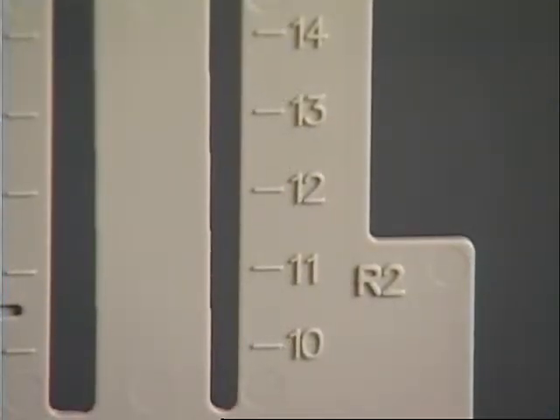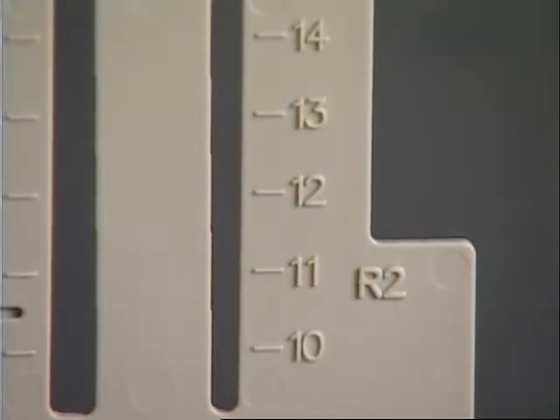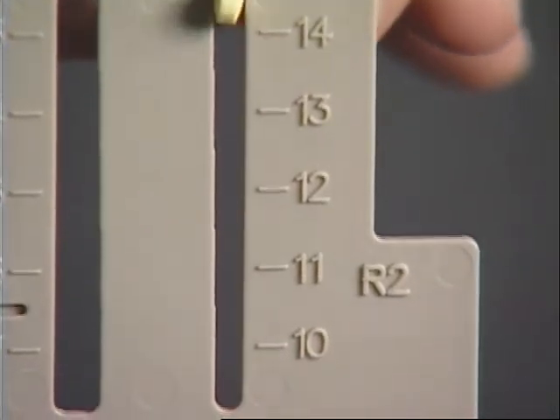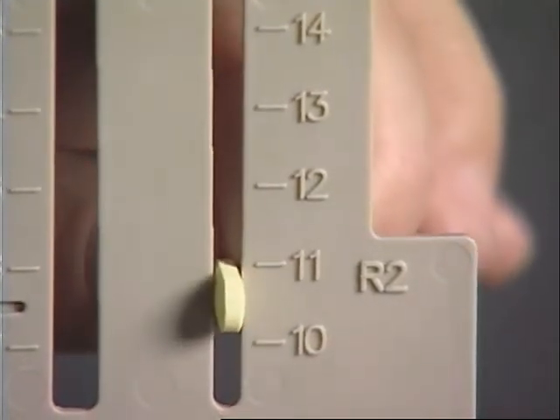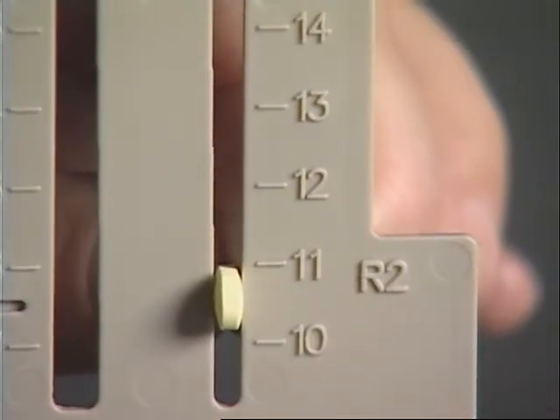The second measurement we need for caplets and elliptical tablets is the domed edge. Insert the med into the track. Proceed down until it stops. This particular measurement is an 11.